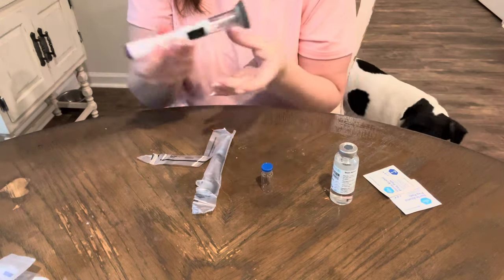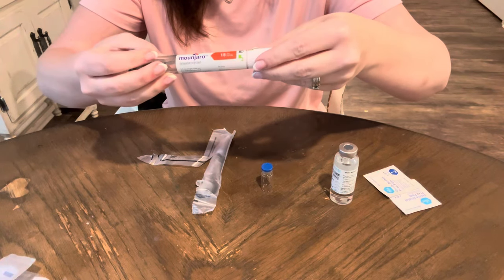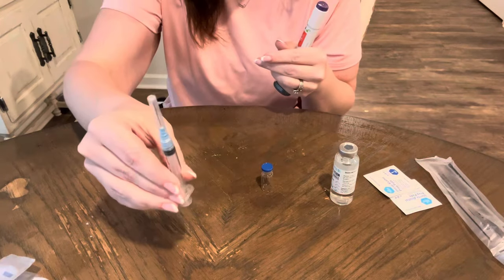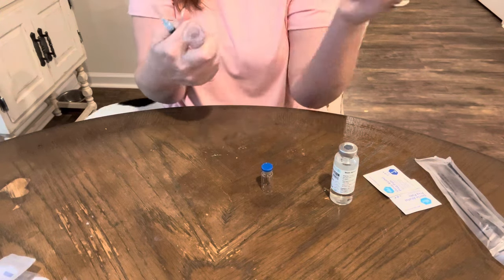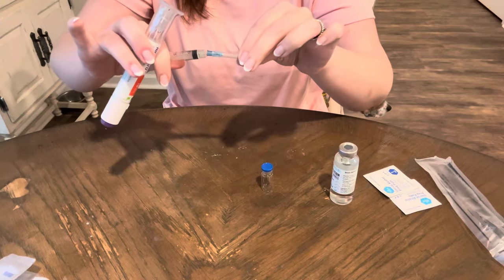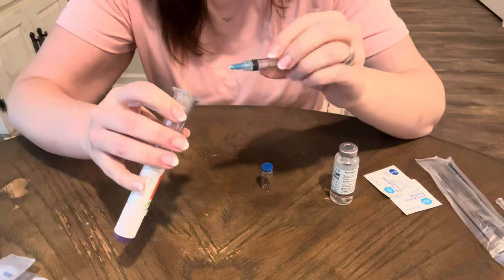The first thing we are going to do is take our Manjaro pen. You are going to leave it locked — do not unlock the Manjaro pen, because that poses the risk of accidentally hitting the button and the medicine injecting out. Take your larger-gauge needle, take the cap off the Manjaro pen — it's locked, so it's not going to eject — then take the cap off the larger needle and fit it directly over the pen's needle. It should just slide right on there.